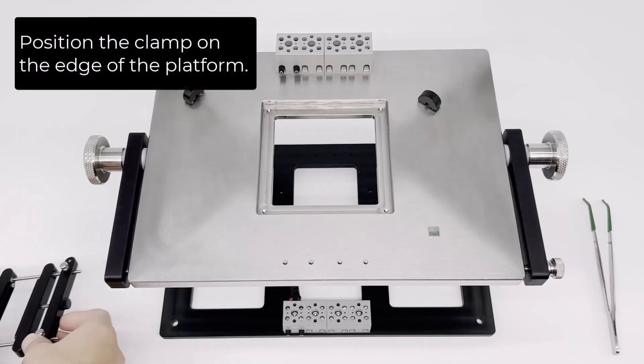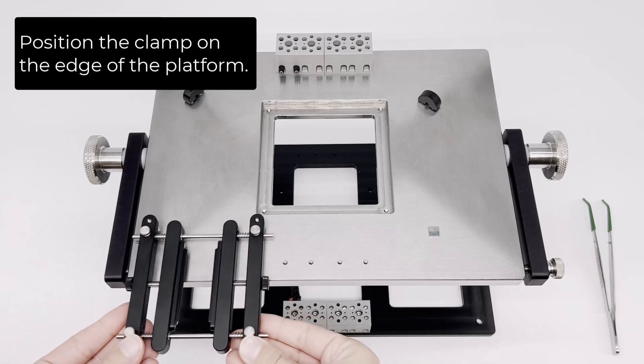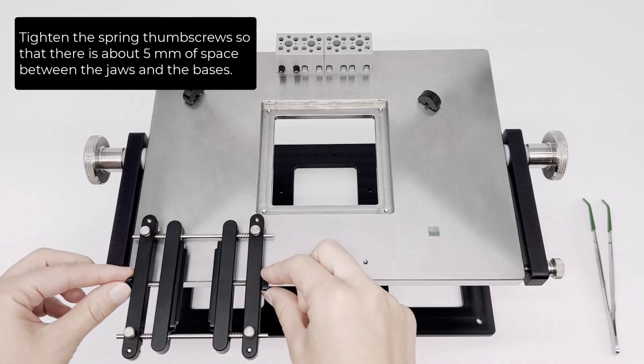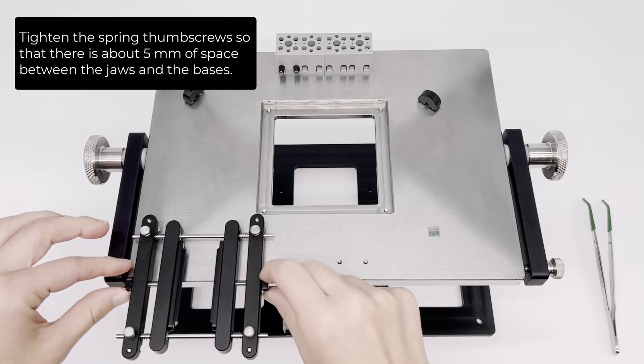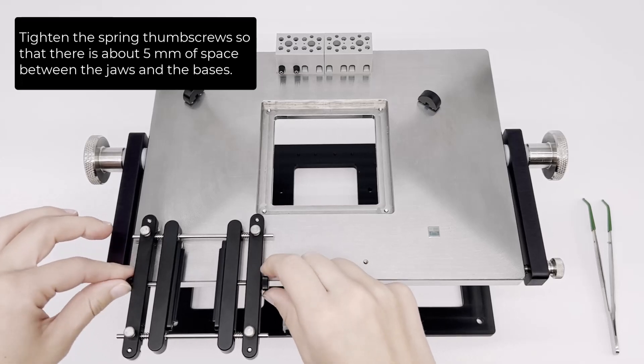Position the clamp on the edge of the platform. Tighten the spring thumb screws so that there is about five millimeters of space between the jaws and the bases.